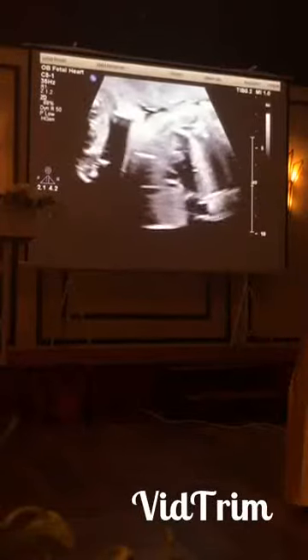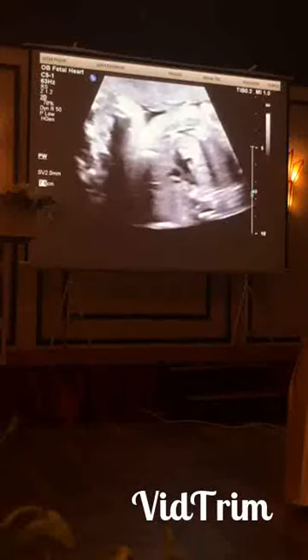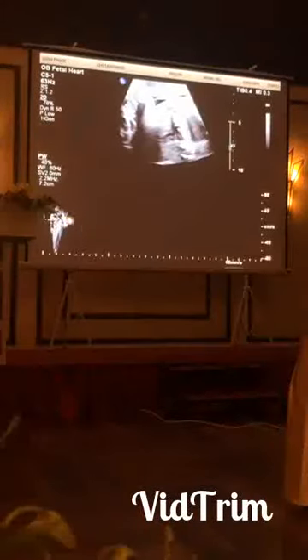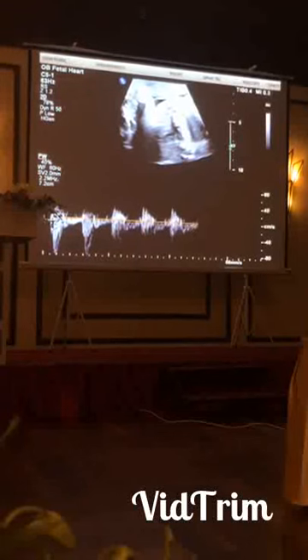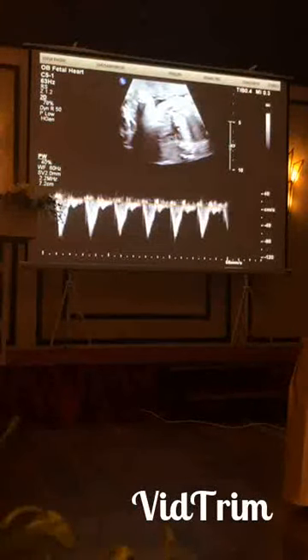Can you put a pulse wave into the arch here? Somewhere at the junction. Yes, you see this diastolic flow. It's quite typical also when they have a real aortic arch problem, that there is a forward flow, but there is also a diastolic wave.